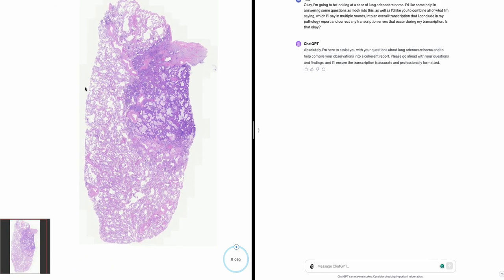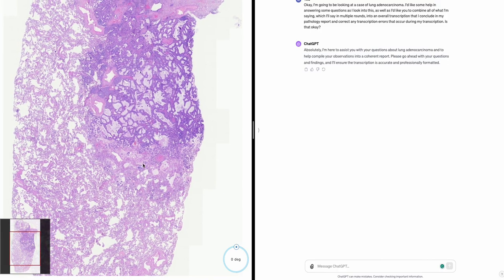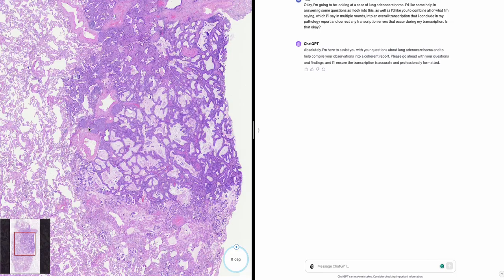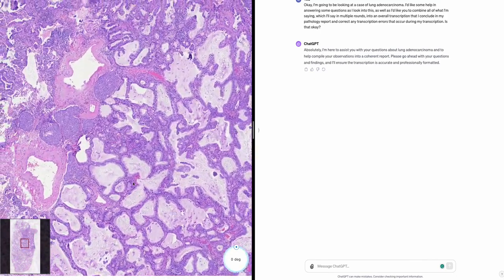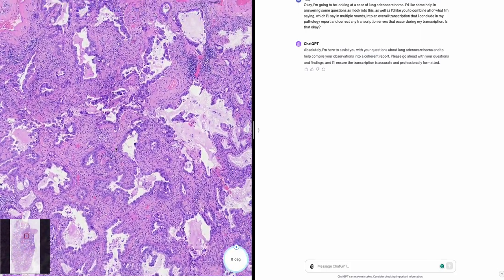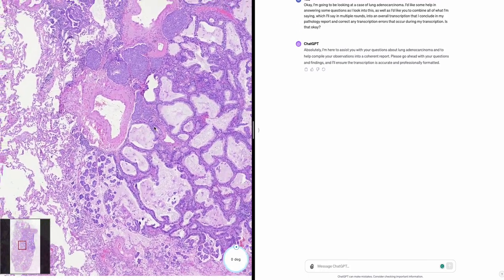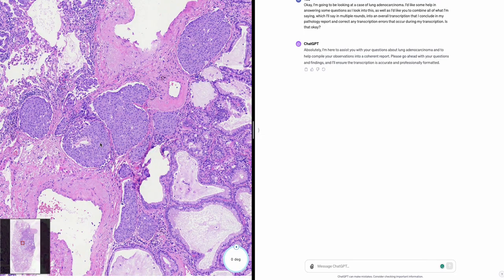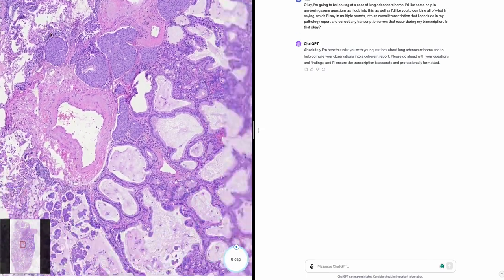Looking at a lung pathology slide with my personal pathology co-pilot. It looks like a lung lobectomy specimen showing a lung adenocarcinoma with various histologic patterns. Some of these I'm worried are high grade — could you remind me of the high-grade patterns in lung adenocarcinoma and describe them?